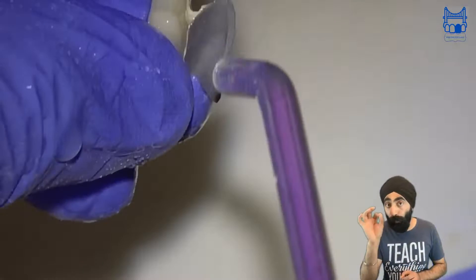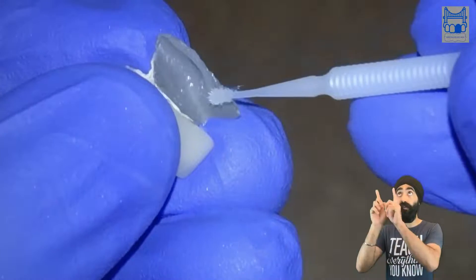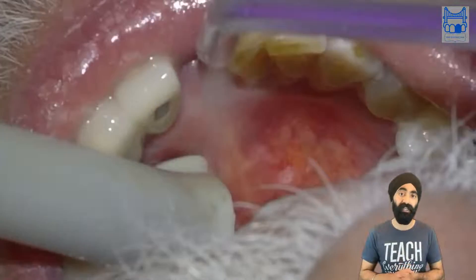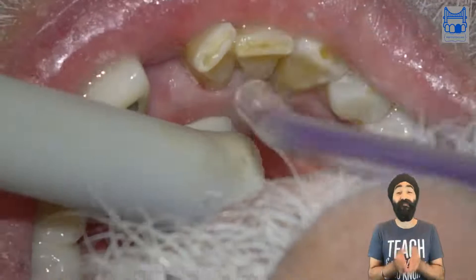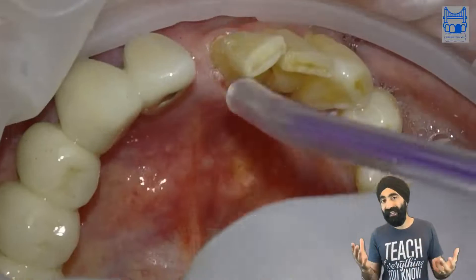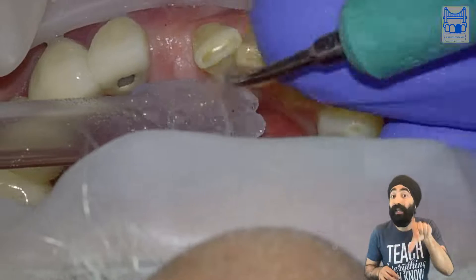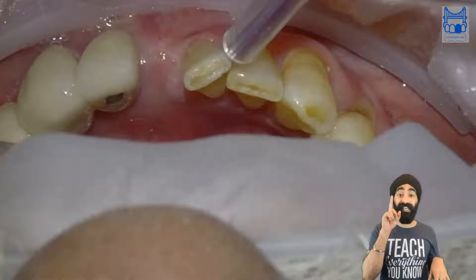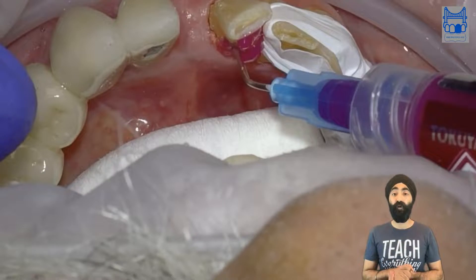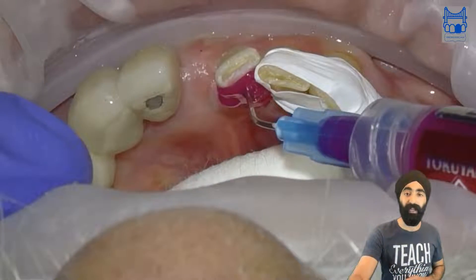I air abrade again to get that optimum oxide layer, which is really important when you're working with metal-based resin bonded bridges and also zirconia. I'm putting on the ceramic primer as part of Panavia V5, which contains everything you need to get the surface active to bond the Panavia onto it. I use Panavia V5 currently. I then go back and air abrade the tooth — I'm very thorough about getting everything super clean. I put an Optragate in. Rubber dam can interfere when placing the bridge — if it's pinching the rubber dam, that's not a good scenario. He had a well-behaved tongue and I'm able to get it lovely and dry. I instruct the patient to breathe through their nose. I also use PTFE to prevent the adjacent tooth from getting etched, which helps prevent cement sticking to the adjacent tooth.